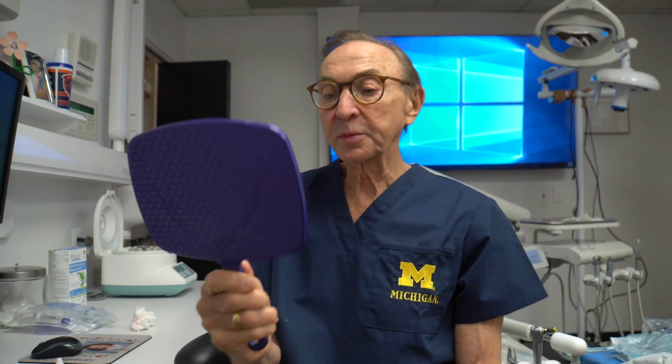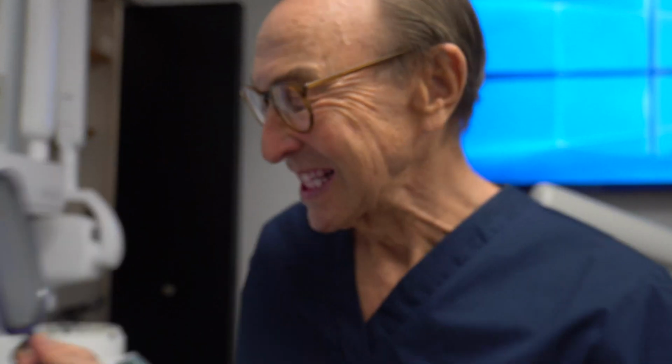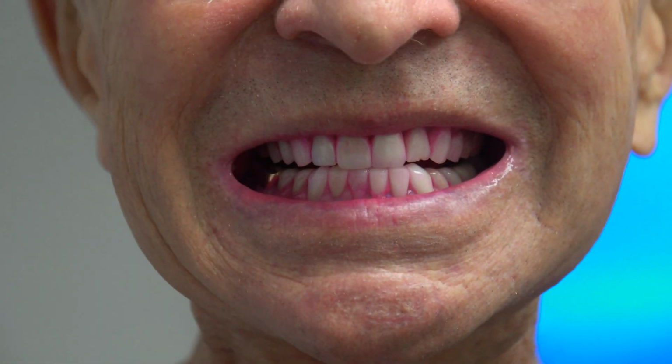And we're going to take a look. I'm going to take a look myself. Okay, so there you are. It's certainly cleaner than it was, but some of the areas between the teeth look like they still have some disclosing solution.